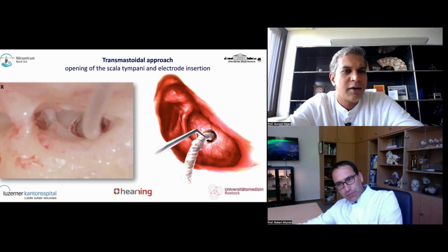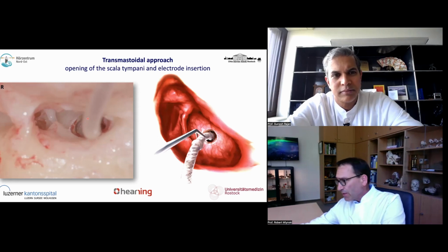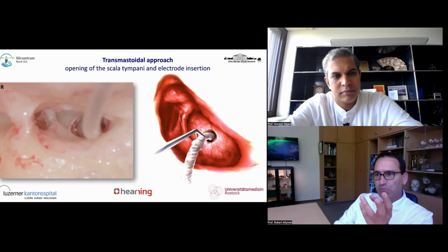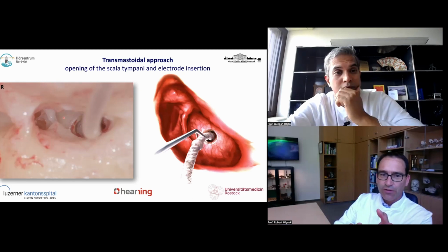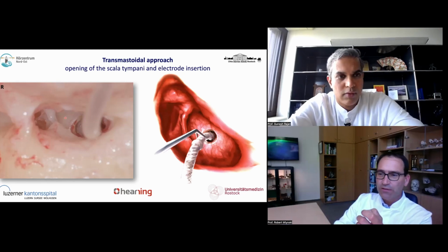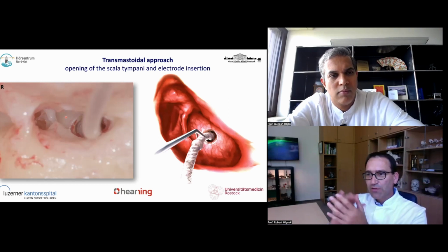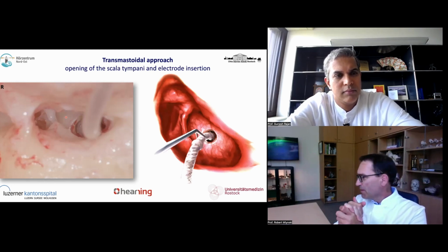Do you have to seal it? Yeah, I think it's good to seal it because you have capillary forces, and you always need to keep in mind that this is outer space. This is environmental air, environmental mucosa. So it's the same as the outside. It's not sterile.